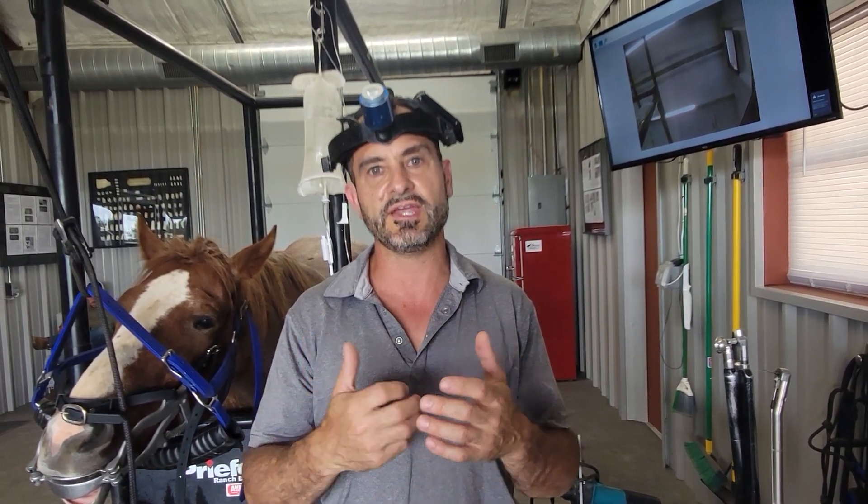If all the x-rays were normal, we might have been able to do a more conservative approach. It's important to figure out how to integrate all that information together and be efficient in doing that process. This horse — we've been working on him 20 minutes and we have a diagnosis, with our maxillary nerve block already in place while the nerve block is kicking in.